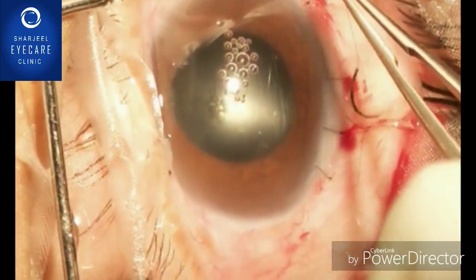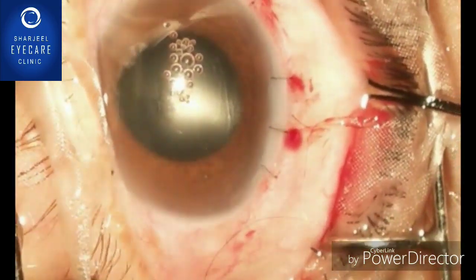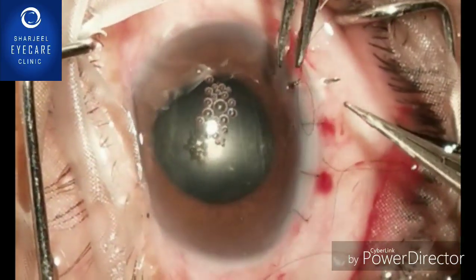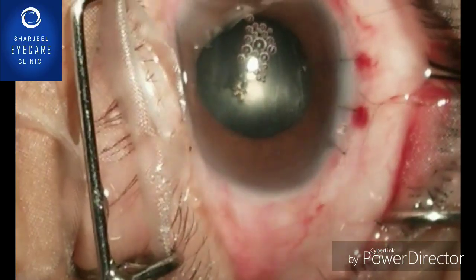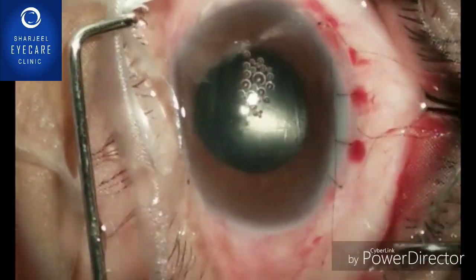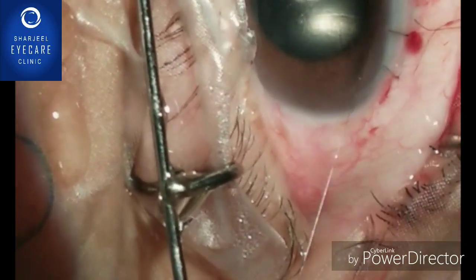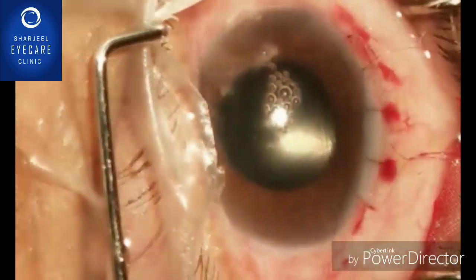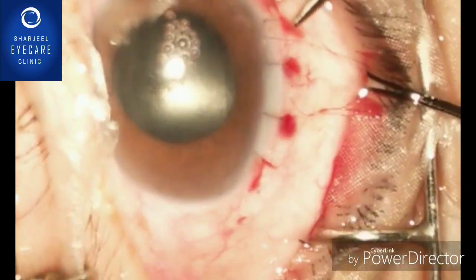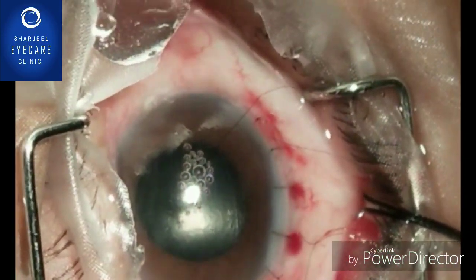After applying three sutures, we remove the remaining lens matter with ease — the zonules were not disturbed. We then apply a fourth suture. In this video you have seen extracapsular cataract surgery and how to manage a subluxated lens. Ideally, if you have a capsular tension ring you should use it — that is safer and more feasible — but if CTR is not available, you can manage the subluxated cataract this way. You should avoid intracapsular and anterior chamber intraocular lenses, which have many complications. Thank you very much.